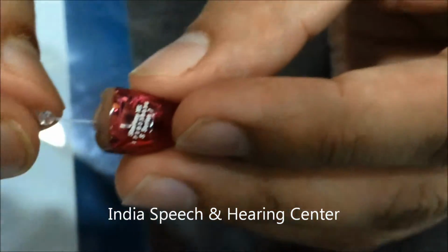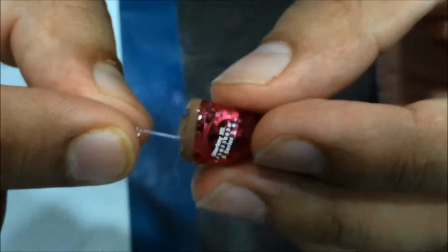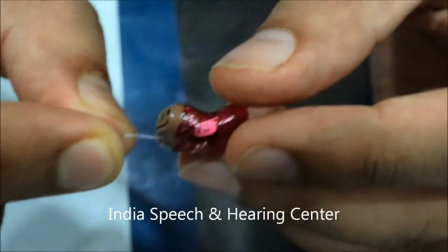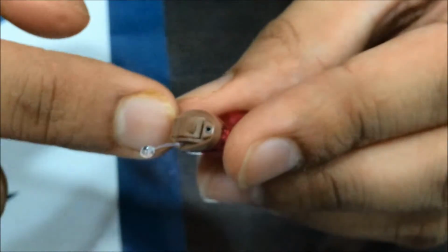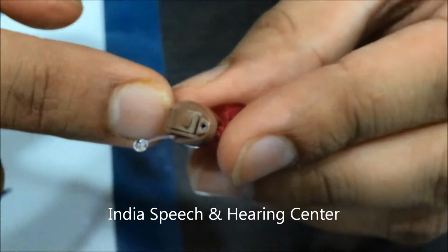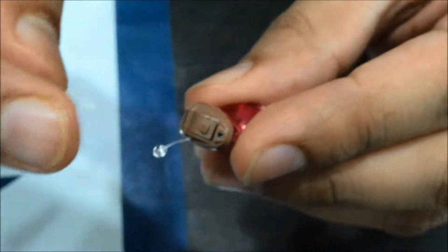The small transparent thread that you see is the pulling thread. This helps you take out the hearing aid from the ear canal when you don't require to use it. Near this thread on the faceplate, there is a battery door. Now we'll demonstrate how a battery is inserted inside the hearing aid.